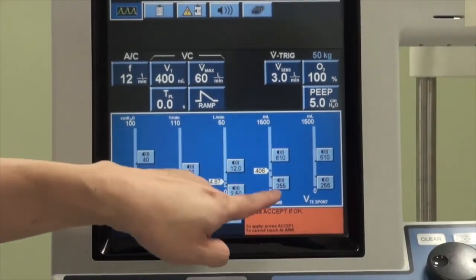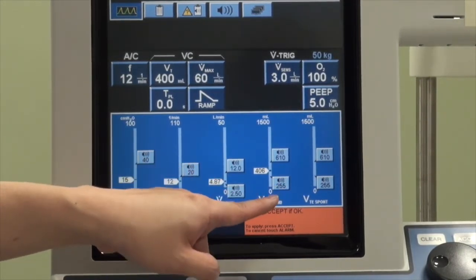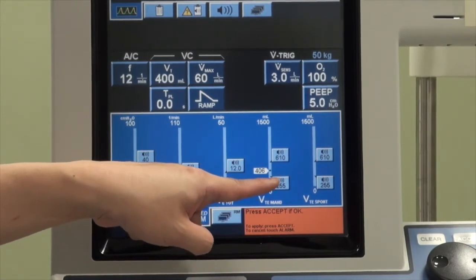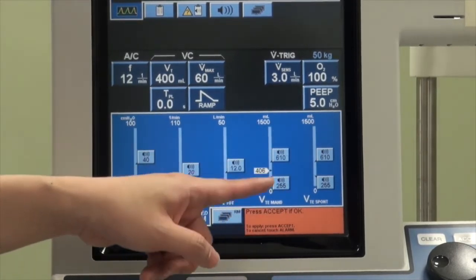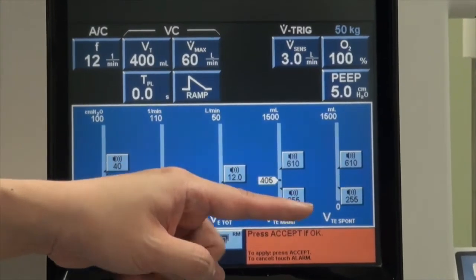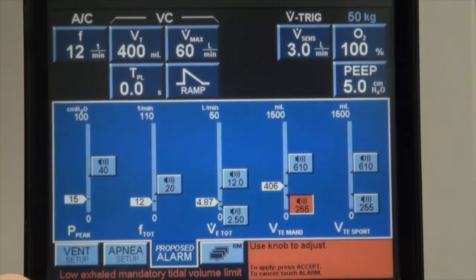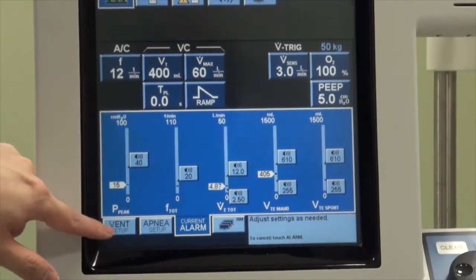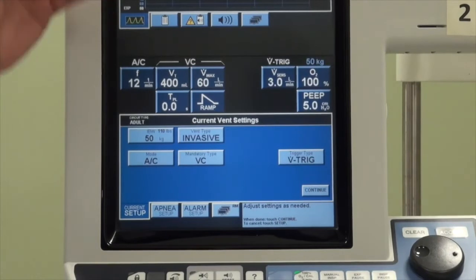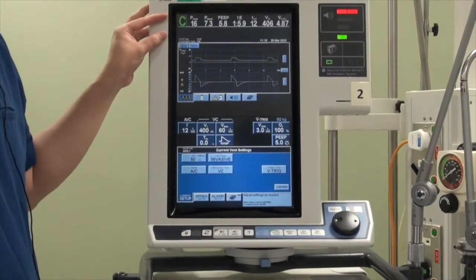The next button is the tidal volume alarm. The safe starting point is about 6 to 8 mL per ideal body weight, so you can set the upper and lower limit to alert you when the patient breathes beyond that range. Once you are satisfied with the settings, press accept and this will be locked in. Whenever the patient is breathing above or below what you have set, you will see an alarm in the top half, alerting you that there is a critical issue and you need to attend to the patient immediately.